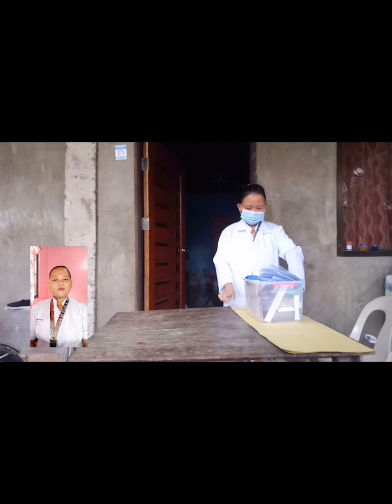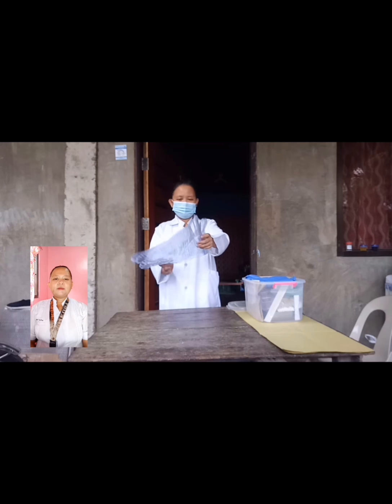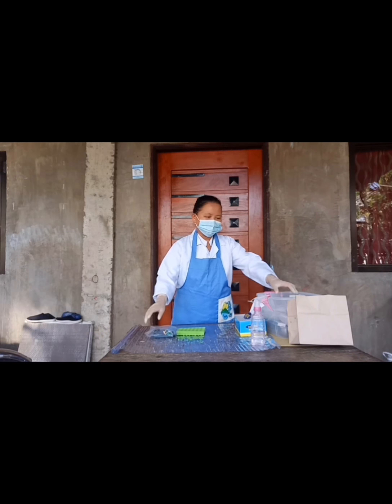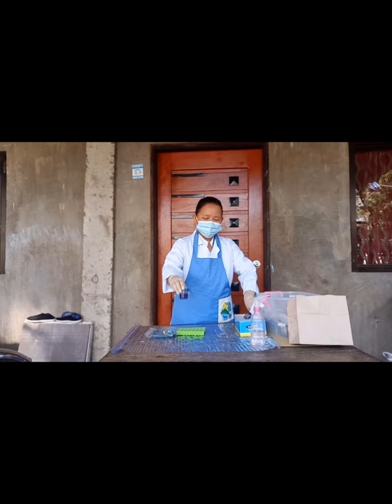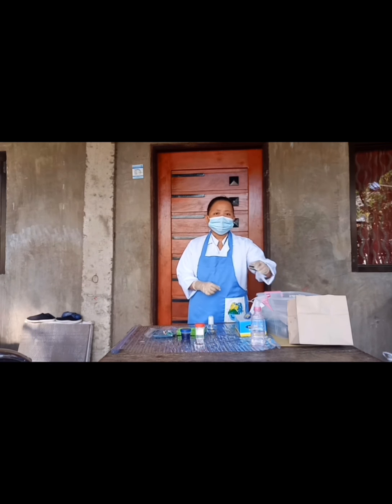Next is to spread the newspaper for the bag to rest on. Place it on a steady, dry place away from the sunlight and garbage. Unbutton the bag, take out all necessary equipments needed: the alcohol lamp with denatured alcohol, test tubes, test tube holder, matchbox, Benedict solution, and acetic acid. They will also be needing the Benedict solution and the acetic acid solution. The alcohol lamp and the matchbox.